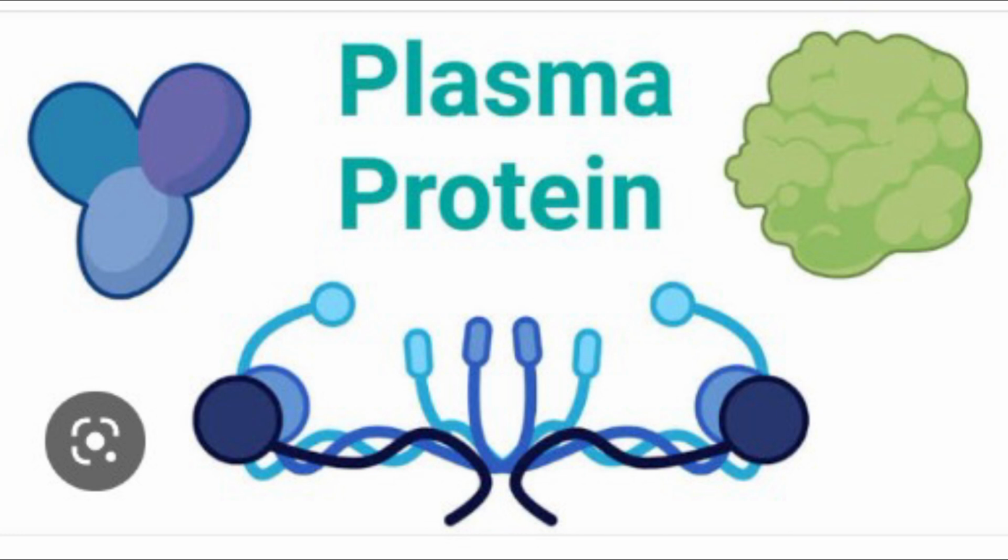Specimen collection and preservation. Either a random or 24 hour urine sample is collected with toluene as a preservative. The cerebrospinal fluid sample is collected without any contamination by blood components. Samples may be stored for 3 months.